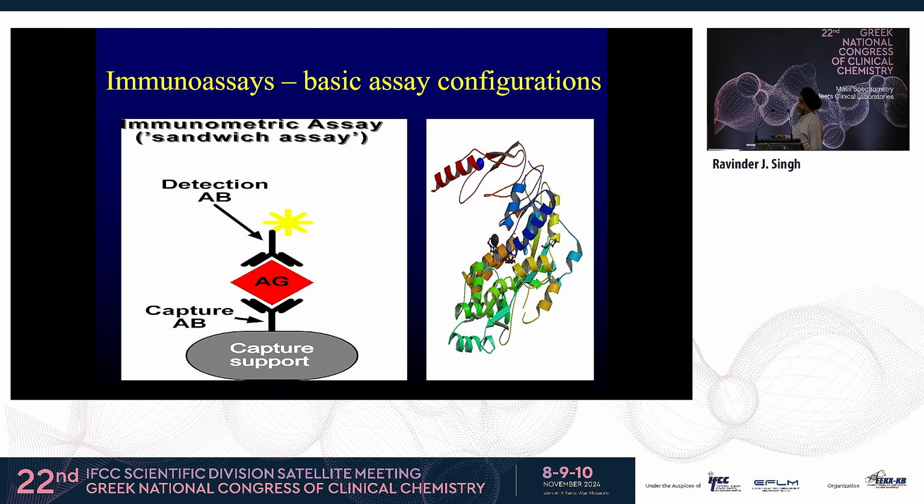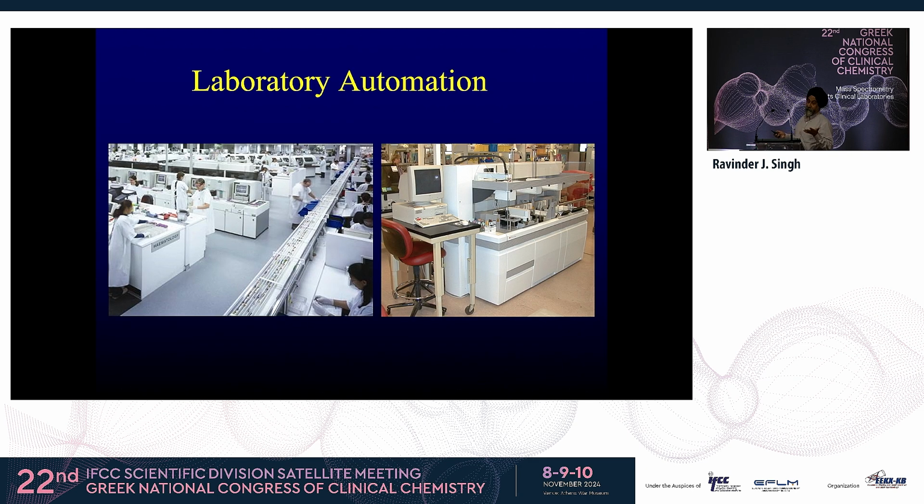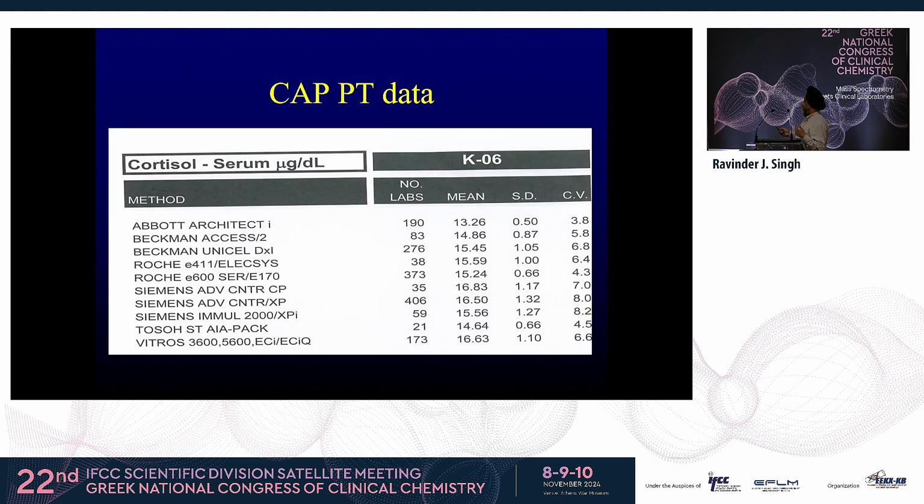But for the sandwich assays like ACTH and SHBG, I think these sandwich assays have done very magic, and these automated platforms are very reliable most of the time. But we cannot use two antibodies. That's the message here. For small molecular weight molecules like steroids and others, you can only use one antibody, and one antibody brings problems along with it. Ideally, because we don't have a lot of workforce, not a lot of people are interested, or LC-MS is not that common, everybody would like their lab to put the sample on the track and get the results in 30 minutes, but it's a necessity that we provide not only rapid results, but also accurate results.